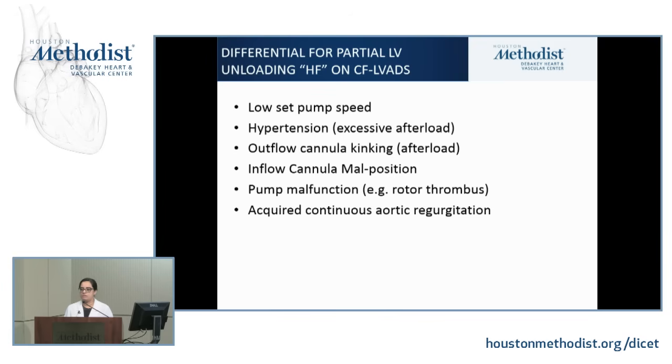So one of the things, and I would ask fellows to focus on it, when you're reading an LVAD echo, look at their MAP also. Because if their MAPs are high, you're dealing with hypertension, and that could be a reason, that could be modifiable at the time of the echo, like you do for MR. You know how everybody knows what the blood pressure was when the MR study was done. Similar is for LVAD, it's important.